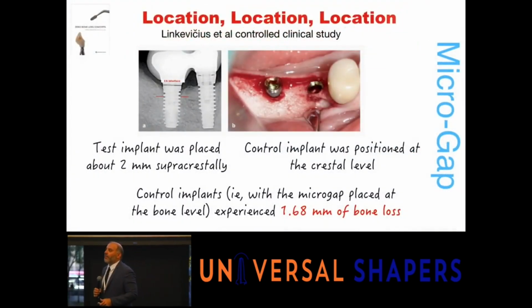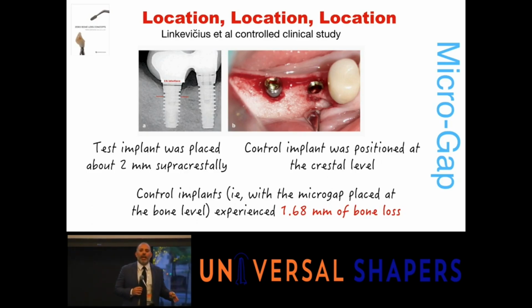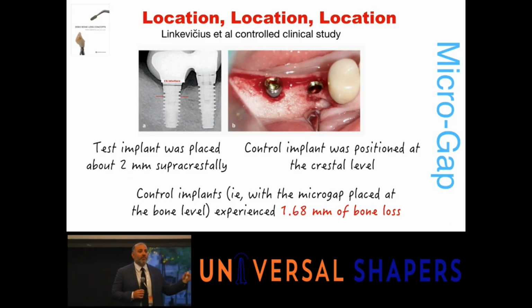But this micro gap, through many studies, including Linkevich, what they would check with that is all about the location of where you place your implants so that you don't have multiple micro gaps too close to each other. The closer the implants are to each other, the more that micro gap is going to stick around and start to invade each other. So we want some distance between our implants, at least 3 millimeters.